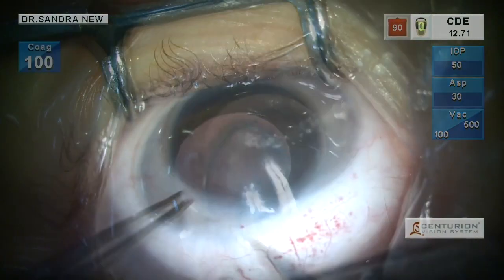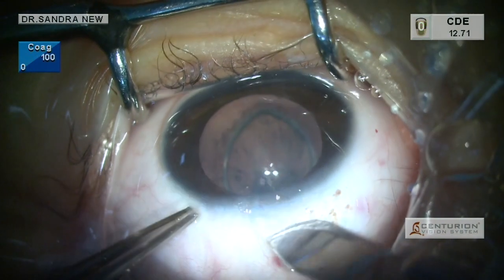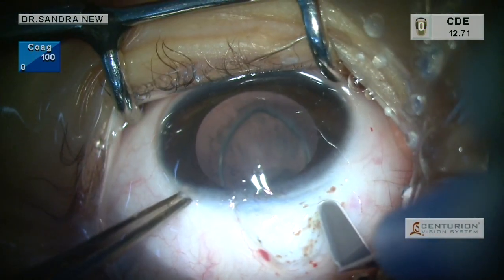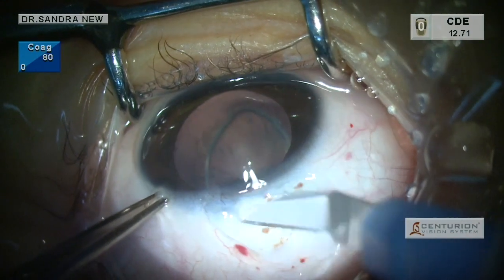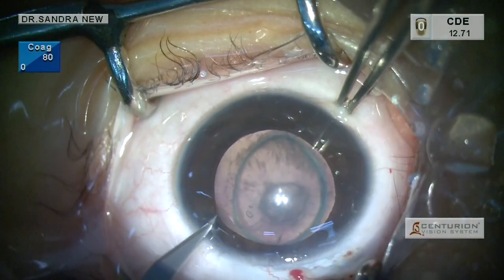I am making a scleral tunnel here. The wound is cauterized. The incision is made around 1 to 1.5 mm posterior to the limbus. Using a crescent blade, a tunnel is being fashioned carefully.